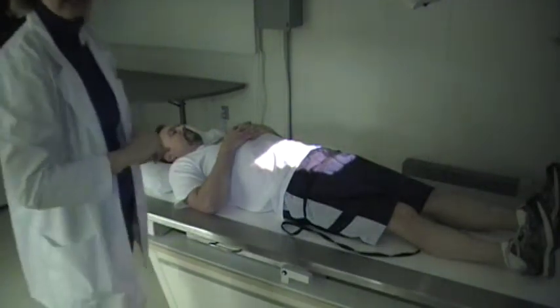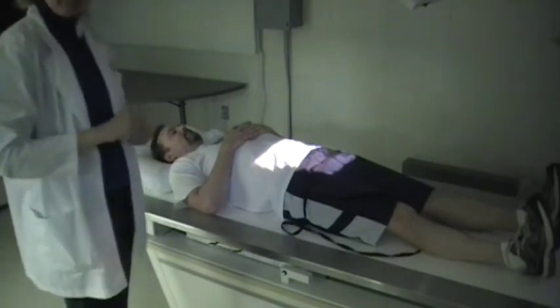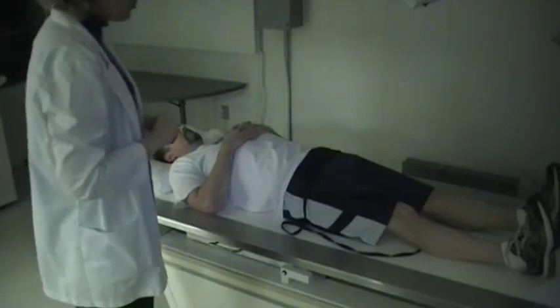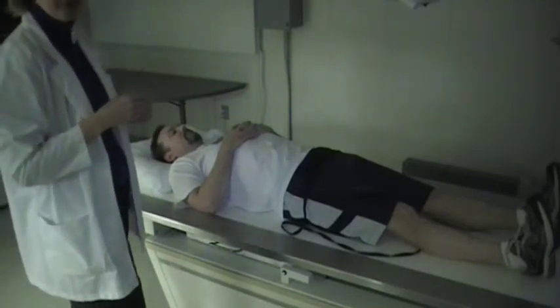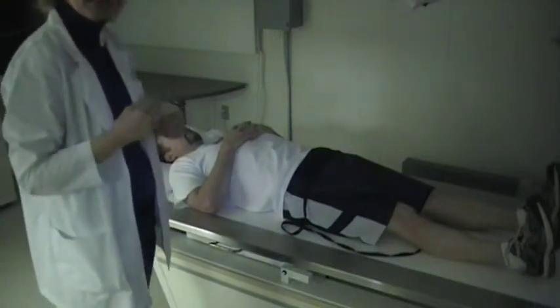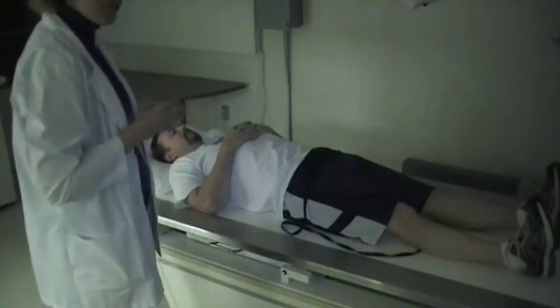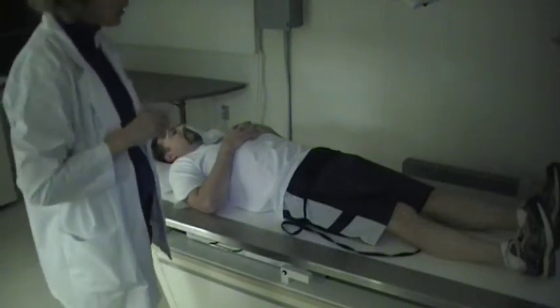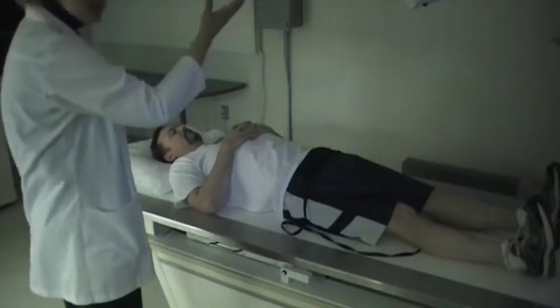We're going to be doing some sacroiliac joints, often known as SI joints. For the AP axial of the SI joints, you're going to want to have a tube angle. It ranges from 30 to 35 degrees. Typically, you'll use the greater angle on women because of the shape of the pelvis. On men, use about 30, so just remember that 30 to 35 range. This is going to be cephalic.